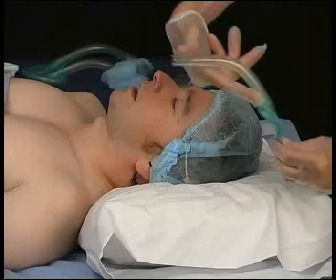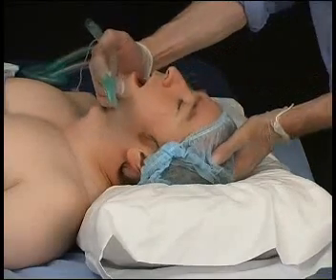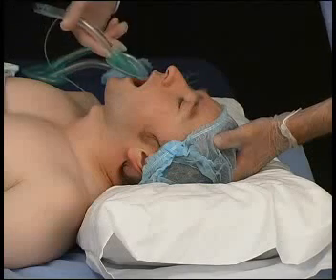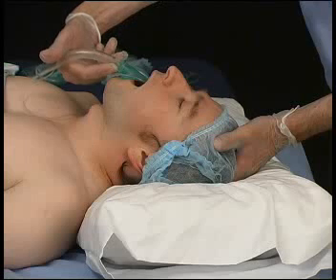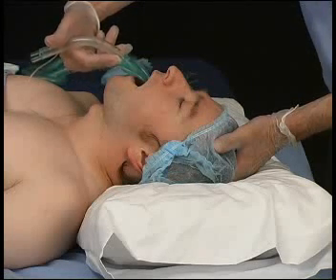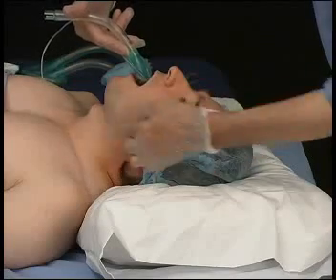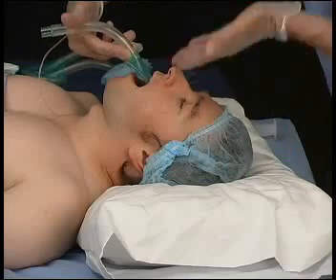Then prepare the patient by tilting the head back and bring the tip of the laryngeal mask airway laterally towards the patient, not downwards, but resting the tip behind the teeth and gums, because you're going to utilize first the hard and then the soft palate of the patient to perform a sweeping action that optimizes the anatomy as an introducer tool. Inserting the laryngeal mask vertically or obliquely brings about difficulties, but following the curve created by the palate, rather than bouncing off the back of the throat, is by far the simplest method of effective insertion.